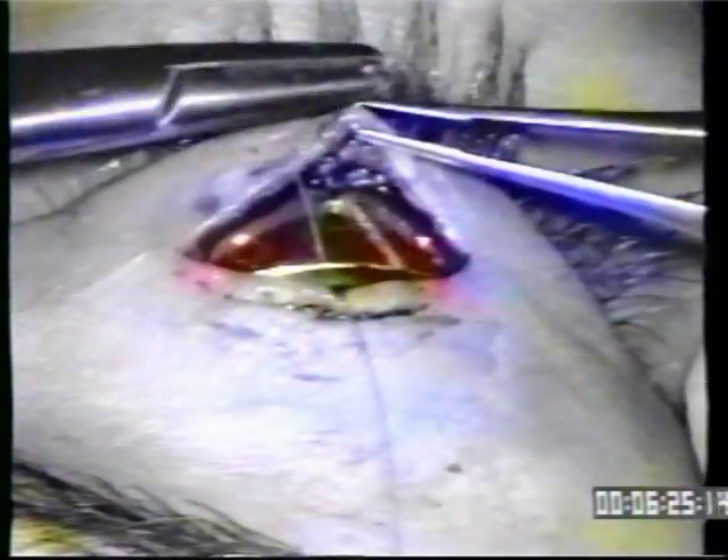We use 7-O vicryl in an interrupted fashion for the sub-Q layer. Enough suture so that the gold doesn't show when you pull the wound apart — sutures are placed in a buried fashion. We check to see if any gold shows; notice a little bit of gold showing there, so you may want to put one more vicryl suture in place to fully cover the gold.